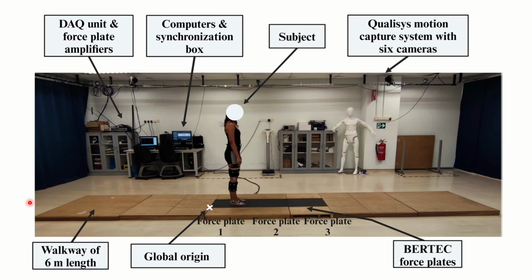Right. Tip number 3, maintain a smooth and flat walking surface for your subject. Whether you use wooden planks like what we did or have your force plates embedded into the floor of your lab, ensure that the movement area is smooth and flat to minimize tripping hazards and to ensure the subject doesn't have to step up a little bit every time they meet a force plate.